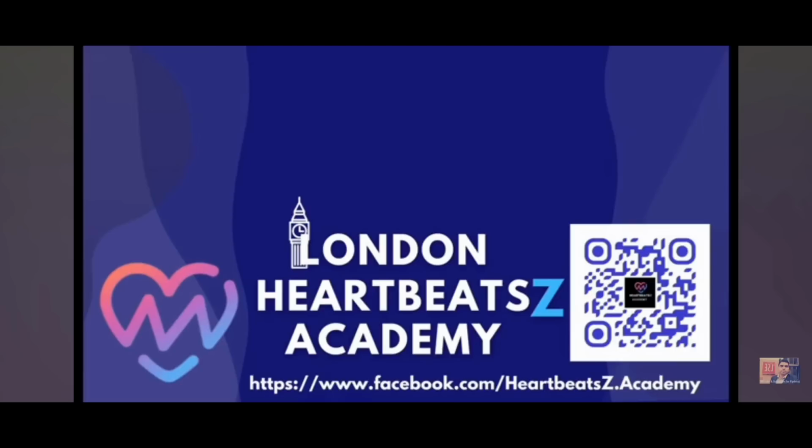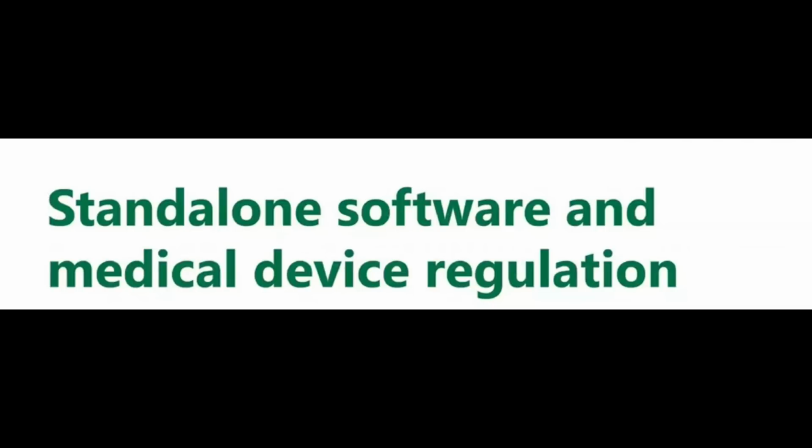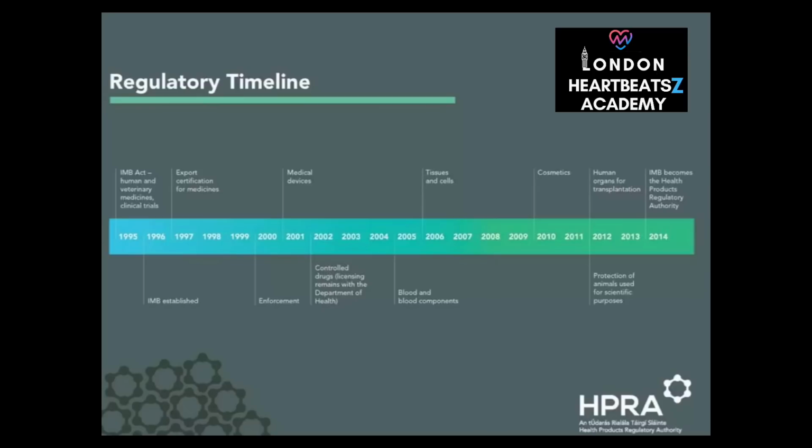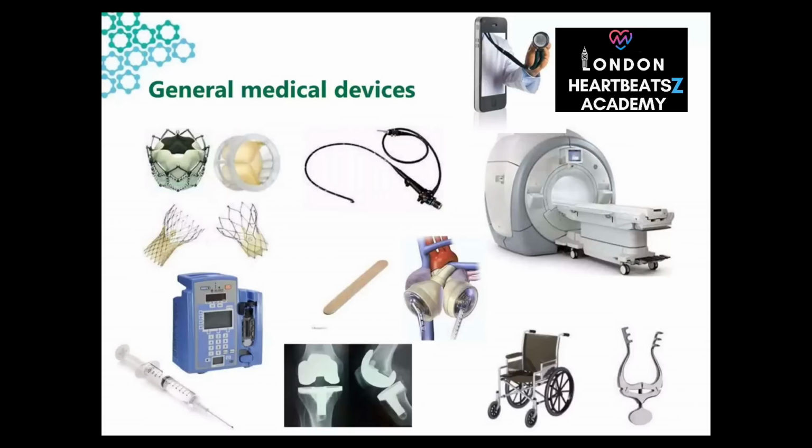To understand how a simple piece of software can become a regulated medical device. It's really interesting, isn't it? It's not always intuitive, so let's start with the basics. What do we even mean by standalone software in the medical context? It's software that's not integrated into an actual physical device when it's placed on the market. Think about an app on your smartphone or a program on your computer. So it's not about the device itself. No, it's about what the software is actually trying to do. It's the intended use. And the European Union has criteria to determine if that software is intended for medical purposes. That's the key.